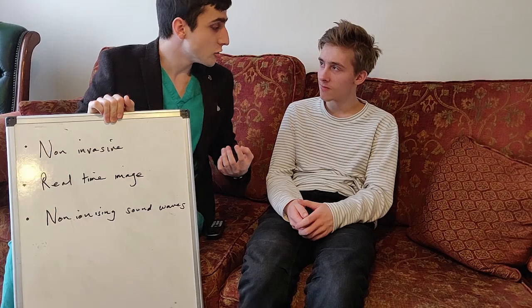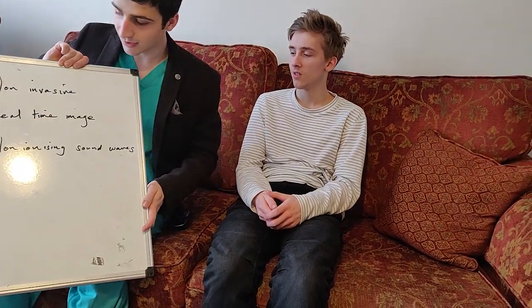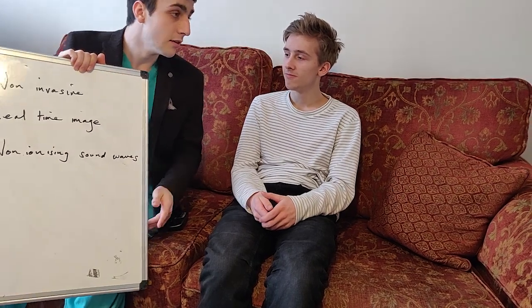Well, here are some advantages I prepared earlier. Ultrasound is non-invasive. I don't have to cut your neck open to have a look. And it is real time. We can analyse how the blood is travelling in your body to work out where your aneurysm is. It is also non-ionising. Some techniques would cause mutation in the cell, but this one is very safe.